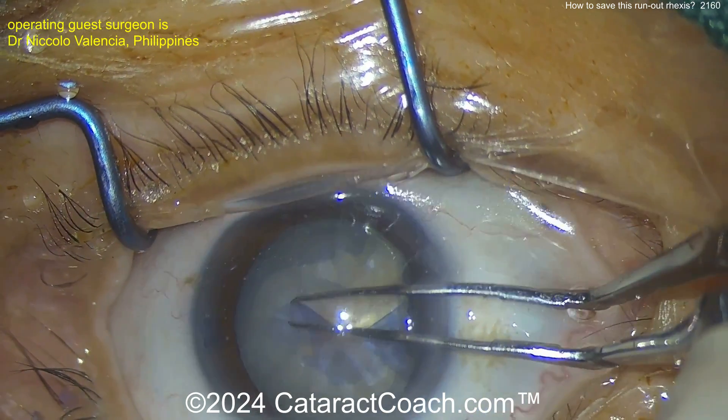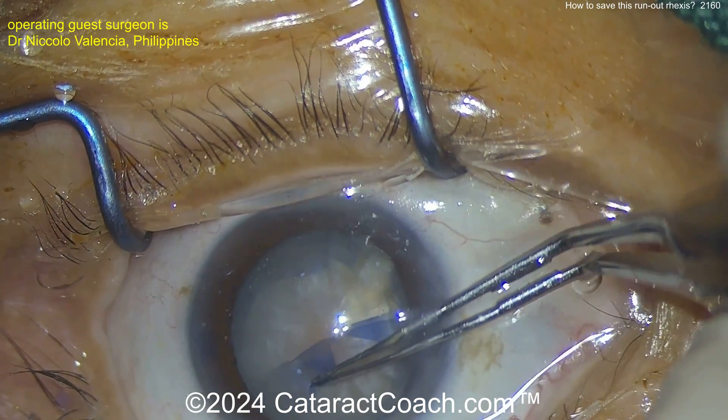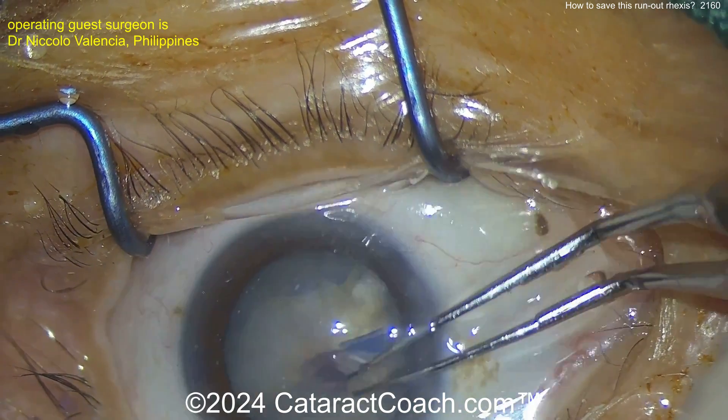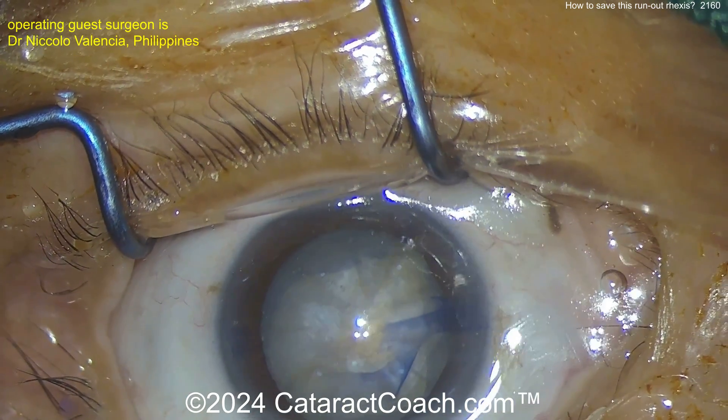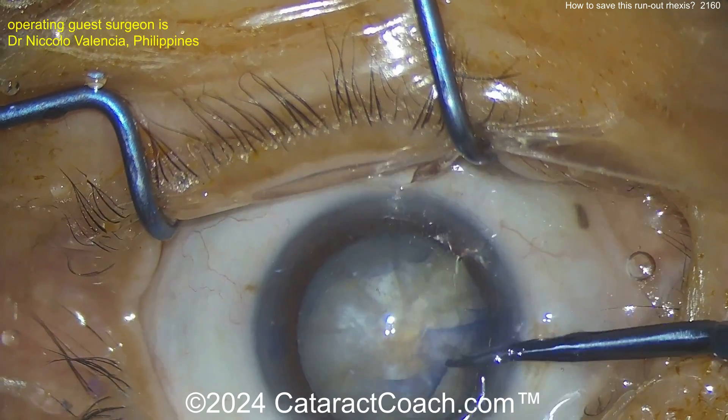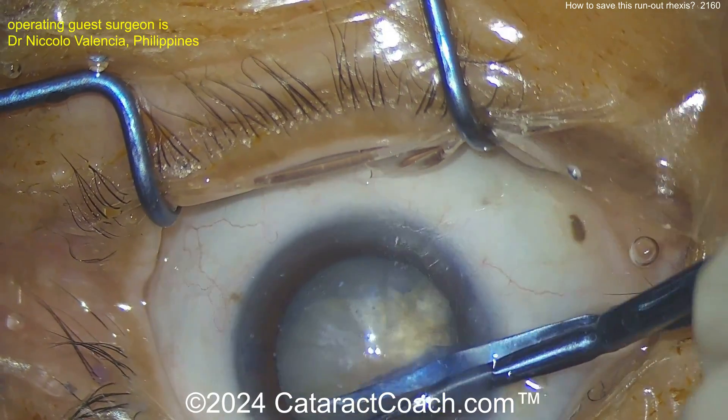What's the risk? If you're not gentle during the cataract surgery, that one area can zip back and extend to the posterior capsule — you'll pass the lens equator all the way to the posterior capsule. If you don't know what the Little maneuver is, go to CataractCoach.com and search for that term.